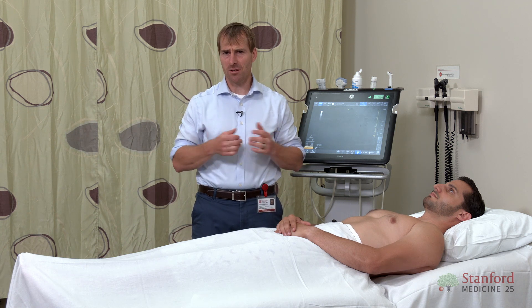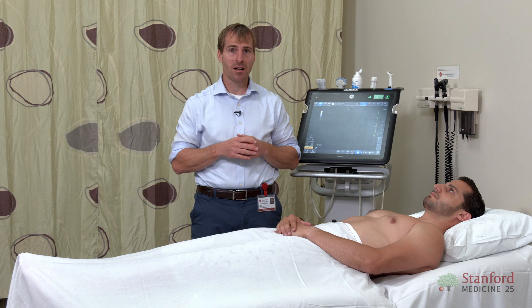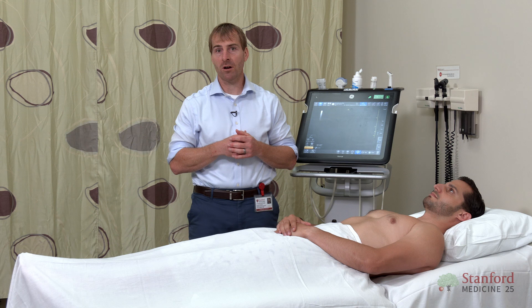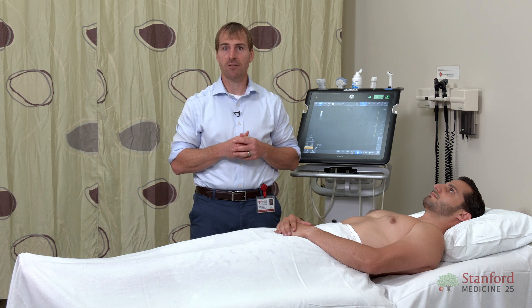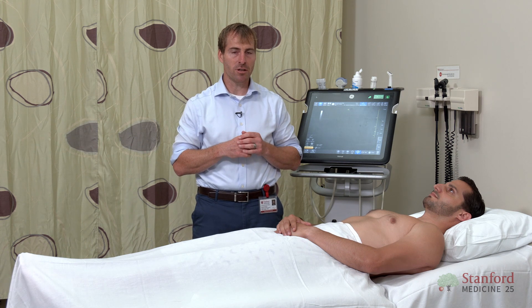What would be a less good question? Why does this patient have abdominal pain? Why do they have chest pain? These are very general questions. If you were to just start scanning the patient to answer a general question like that, there's a good chance you're going to see something you don't know what to do with, and next thing you know, you're subjecting them to additional radiology scans they otherwise might not need. So make sure, before you grab the probe, think about what clinical question you need to answer.